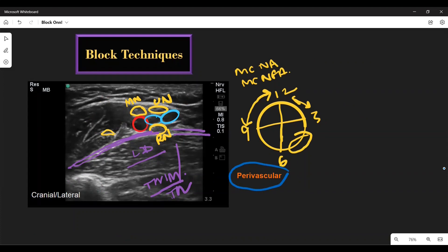In the perivascular technique, the individual nerves are not targeted. Here, two injections are performed posterior and anterior to the artery. Whereas in the perineural technique, the individual nerves are targeted and local anesthetic is deposited around the nerve. Please note: in both cases, the musculocutaneous nerve is targeted separately.